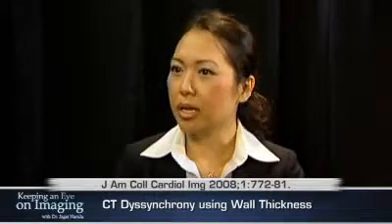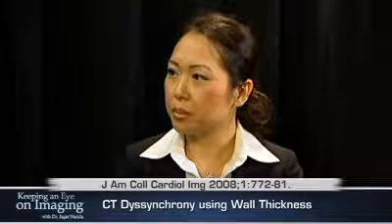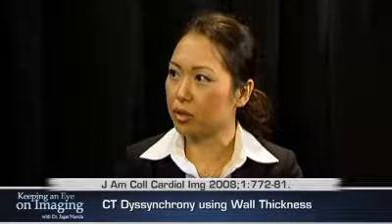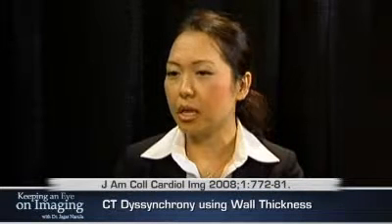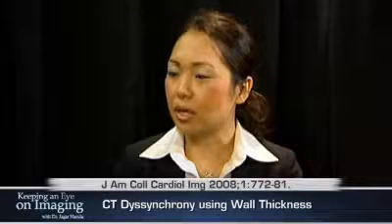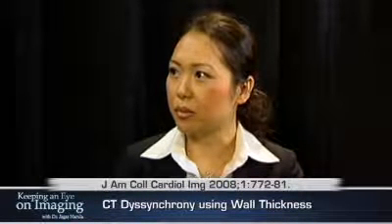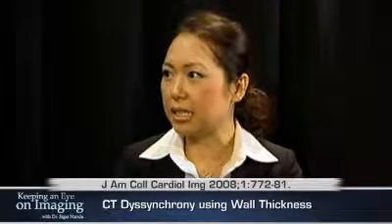As you know, there's currently no gold standard for dyssynchrony assessment, and 30% of patients who receive cardiac resynchronization therapy are considered non-responders and clinically either deteriorate or simply do not improve. So in a proof of principle study design, what we wanted to find was a cardiac CT measure that would be highly reproducible and also determine whether it would be feasible to detect and quantify dyssynchrony using CT.